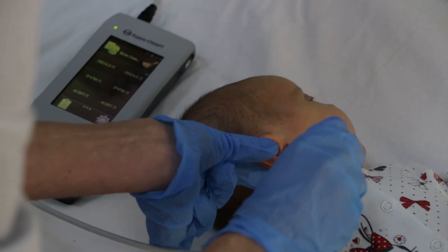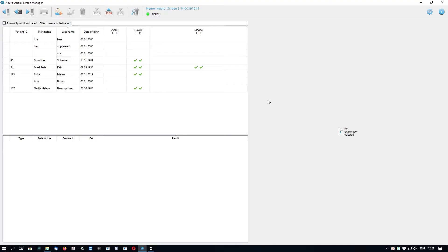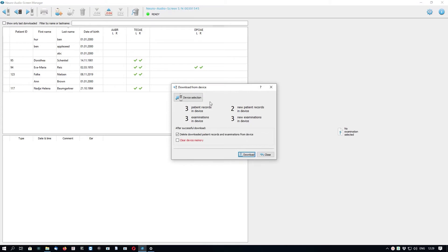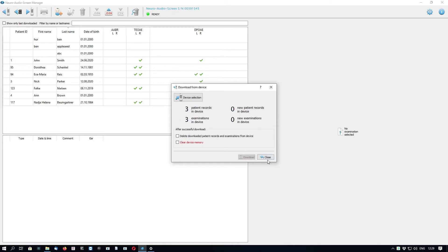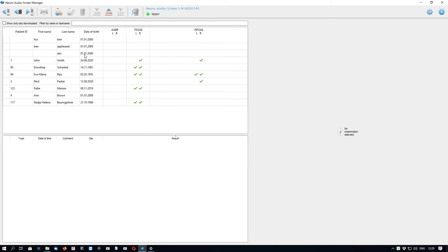Imagine we went with the device to another room to test a baby, performed a screening hearing assessment, and then returned to the computer to download the data from the device. Click the Download from Device button on the toolbar — the arrow points from the device direction. We see several patient records and examinations, some of which are new and not yet in the database. You can also check options to delete downloaded records from the device and to clear device memory after download. Click the Download button, observe the progress, then close. New patients will appear in the table.